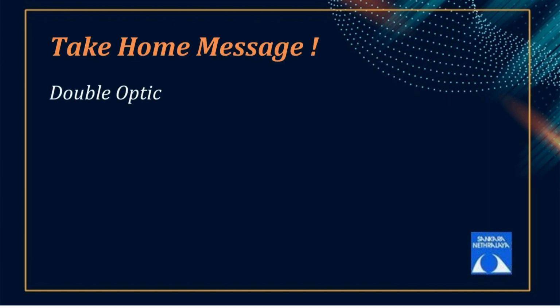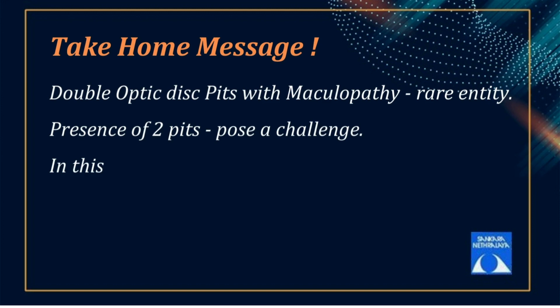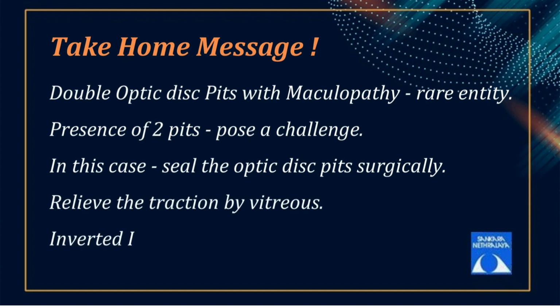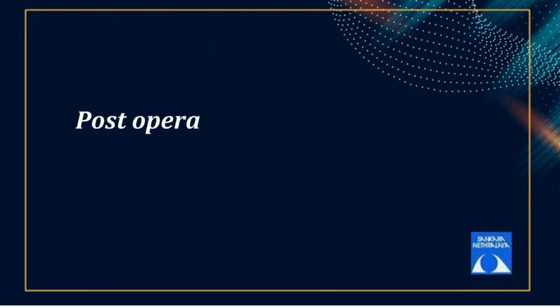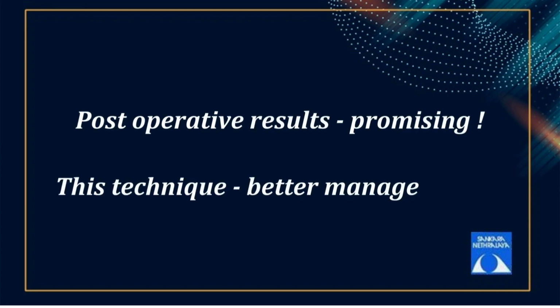The take-home message from this case discussion is, double optic disc pit maculopathy is a rare entity. Presence of 2 optic pits, which could be the reason for maculopathy, pose a challenge for management. In this interesting case, we demonstrate a unique way of sealing the optic disc pit using an internal approach by relieving the traction caused by the vitreous. We also used inverted ILM flap with fibrin glue to cover the optic disc pit. The post-operative results were promising and thus this technique can be tried for better management of double optic disc pit maculopathies. Thank you.